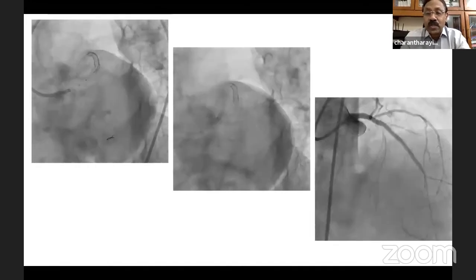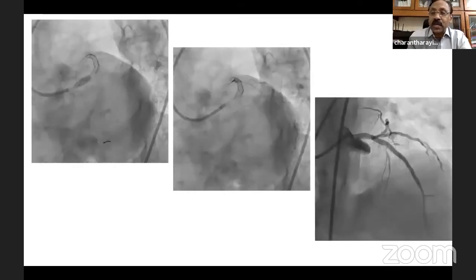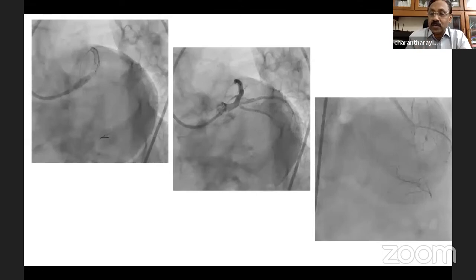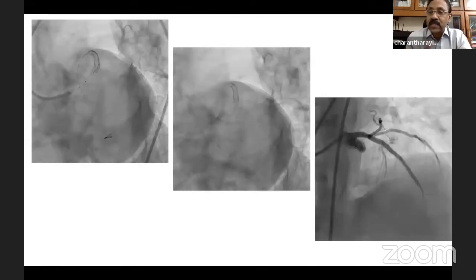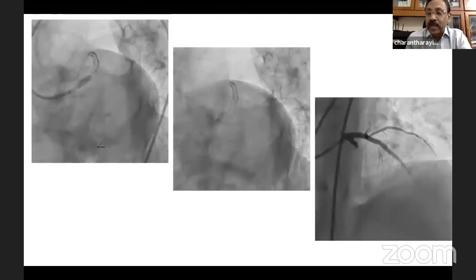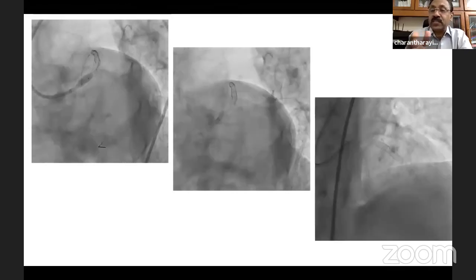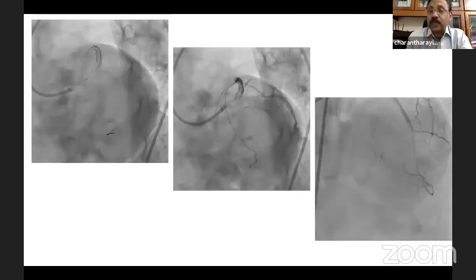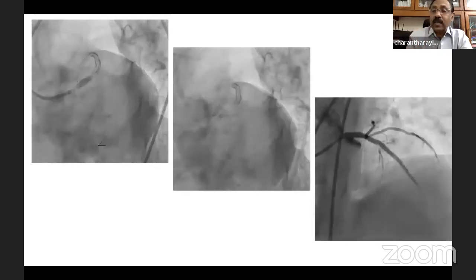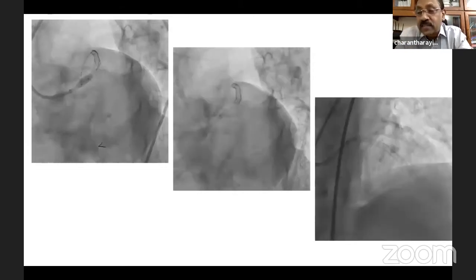One question to Natalia. In the provisional stenting approach in bifurcation, the side branch ostial coverage by the strut and the pattern of it, kissing balloon inflation is not systematic, only in indicated cases. How will the OCT imaging of the side branch ostium and its coverage pattern by the stent strut decide for a further kissing balloon inflation? Is there anything like that?